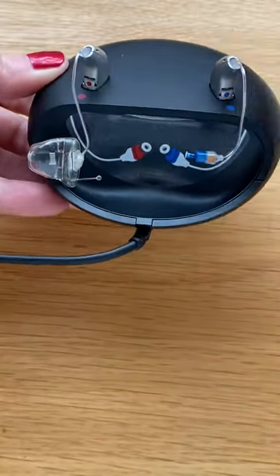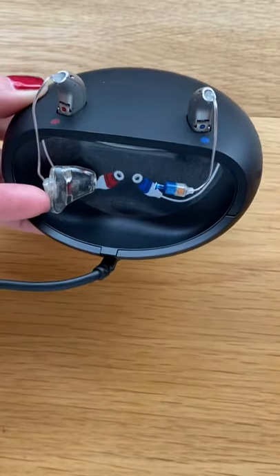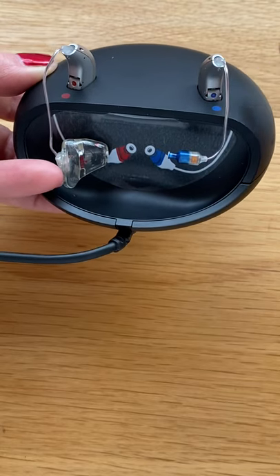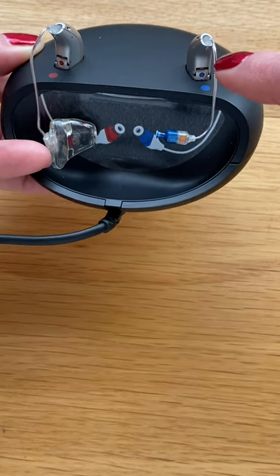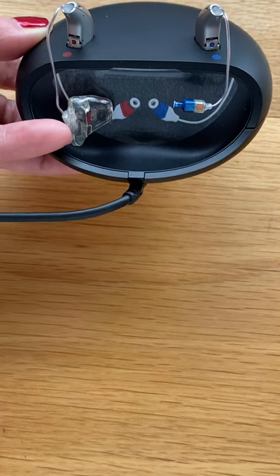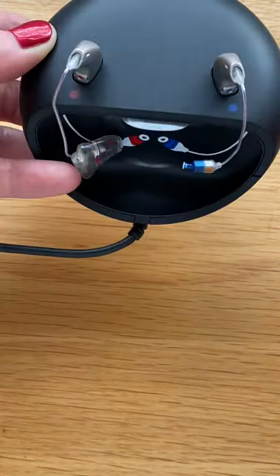We can see here that the instruments are showing the direction of the speaker wire. So the left instrument, the blue dot lines up with a blue dot and the speaker wire dangles down here as per the picture. It is very important to charge the instrument this way.